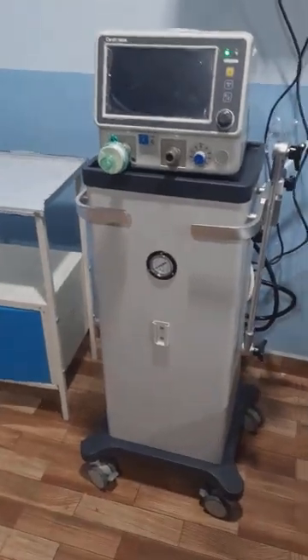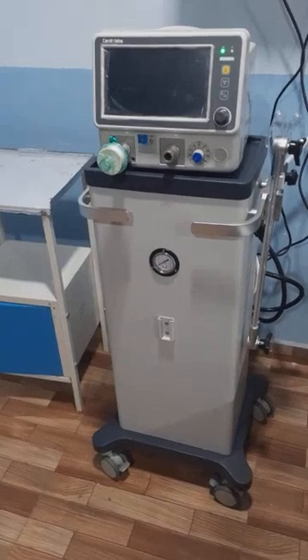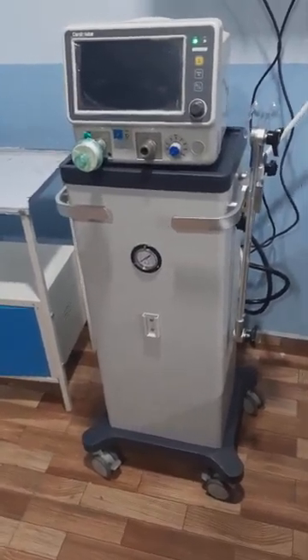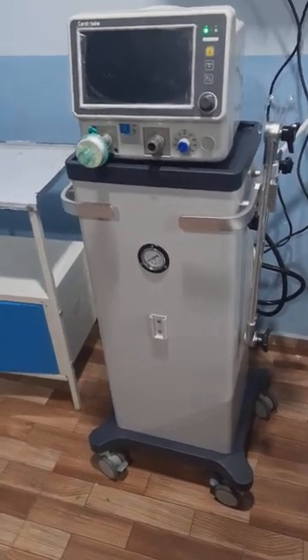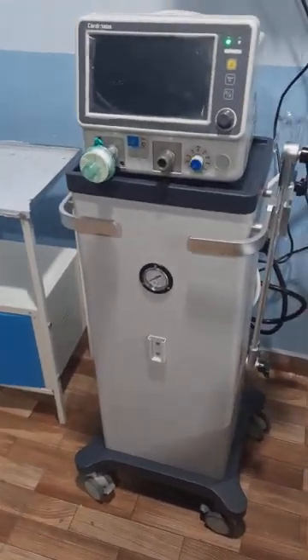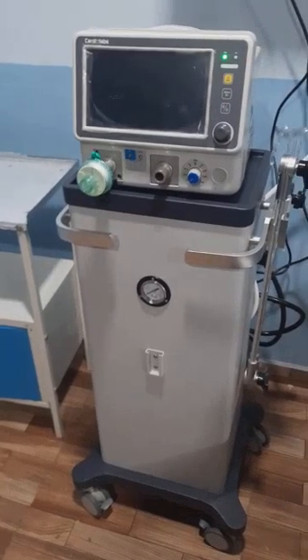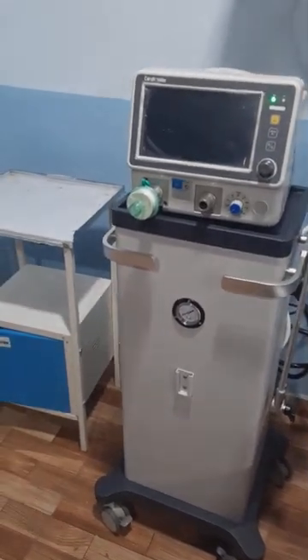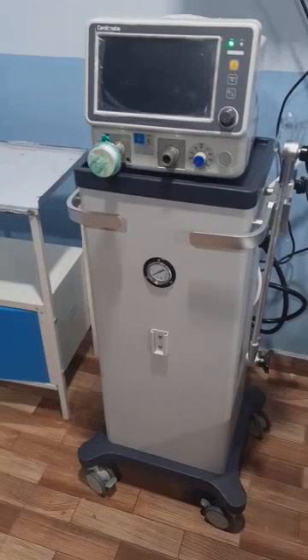Assalamu alaikum viewers, good evening to all of you. We have just installed our new ventilator which we bought from Cardio Labs. This is the OxyVent 9C Plus, the basic model. It has adult and pediatric modes, along with ventilation modes including volume controlled, pressure controlled, and intermittent mechanical ventilation modes.